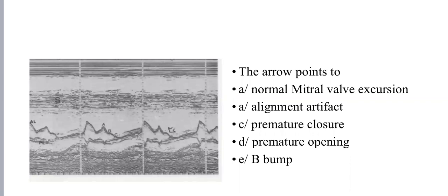Okay, and if I can explain it further, you see the valve is going this way and this way. It's supposed to be the AC shoulder, A to C. This is A above and C is down, so it has to go smooth and steady.